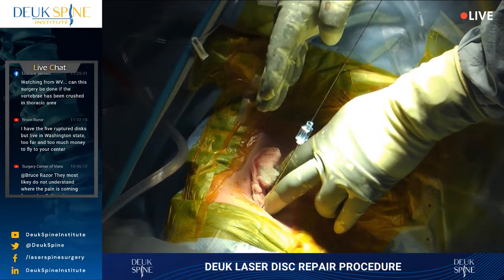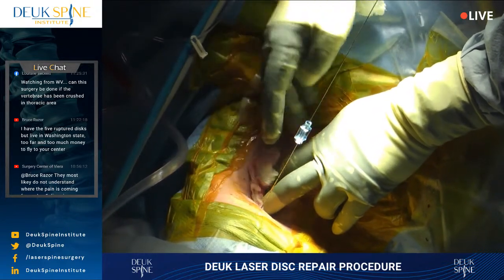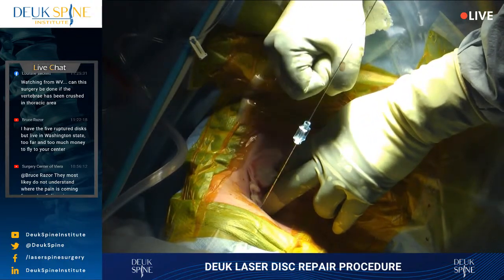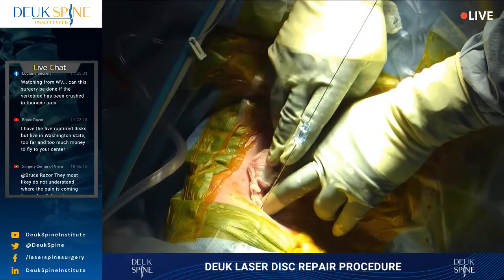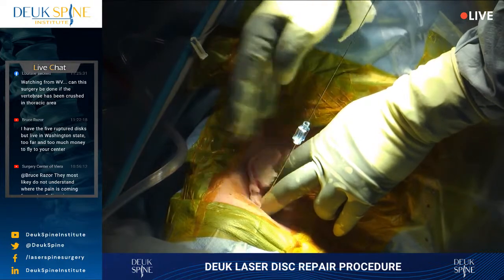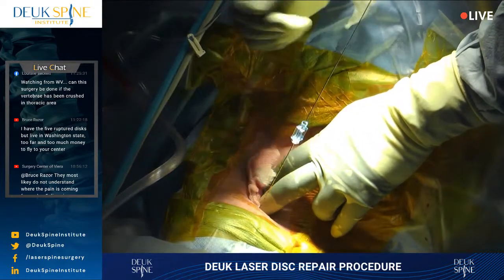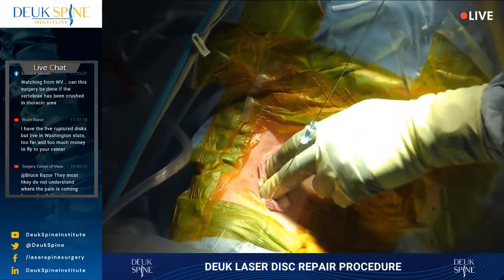because their neck is completely relaxed, there's no tightening of these muscles. If I took my finger and stuck it on your neck right now and you're awake, your muscles will all tighten up and push my fingers away, and you'll gag. But when the patient's asleep, I can push everything over and not get that reflex contraction of the skeletal muscle in the neck. So that's really the main reason I do it this way, is I can feel the spine better.